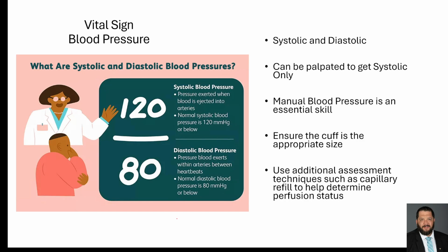The very last number that you heard a heartbeat at will be the diastolic pressure. At all pressures lower than that, you don't hear the heartbeat sound. That's your diastolic pressure. Your systolic pressure is the pressure that's exerted on the vessel during systole, or the systolic contraction of the ventricles. Okay? The diastolic pressure is the blood pressure that exists in the vessels, in the artery, when the heart is at rest. So systolic pressure is the force pressure when the heart contracts. Diastolic pressure is the resting pressure within the heart itself, or within the vessels.